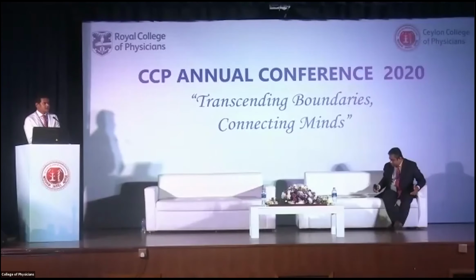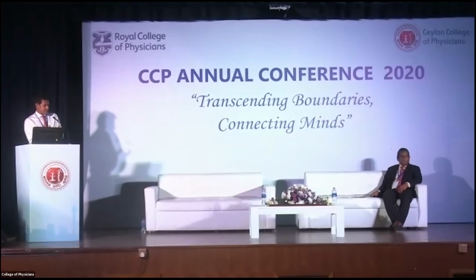So if you consider a patient with acute MR or an acute AR, the clinical scenario would be cardiogenic shock or pulmonary edema. In focused echocardiography, I told you there are several questions that we have to answer. What is the LV function? Is the LV dilated? What is the volume status? With the lung bases, and whether there's pericardial fluid.